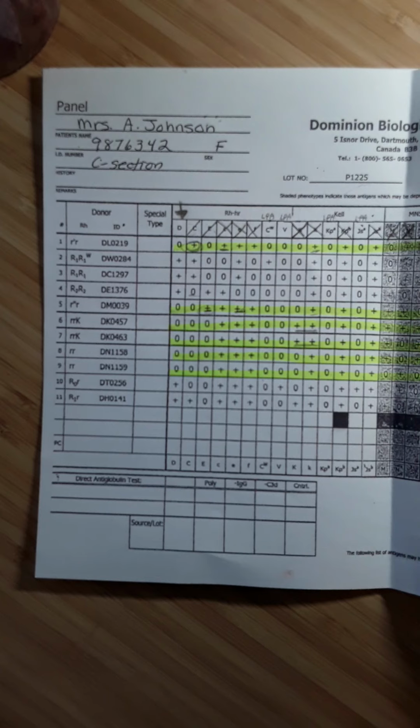And step number 6 on page 10 says to ensure there is adequate evidence to prove the suspected antibodies. And we must satisfy a rule that we call the 3-3 rule. So we need to have at least 3 D positive cells that did react and at least 3 D negative cells that did not react.